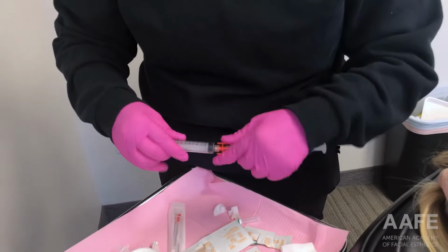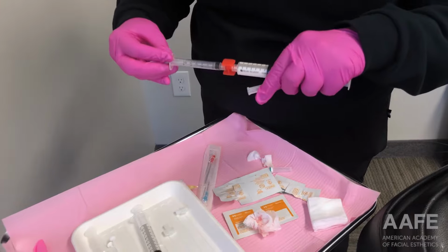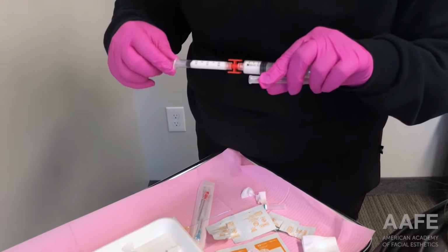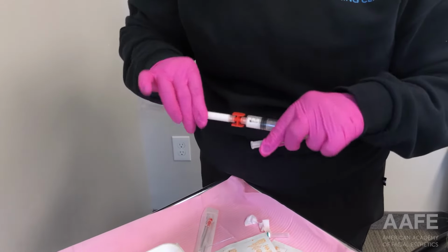Welcome back. Today is part 2 of a Hyperdilute Radiesse treatment for this patient. Last week you may have watched her temple treatment, and today we are working on her face with Dilute Radiesse.